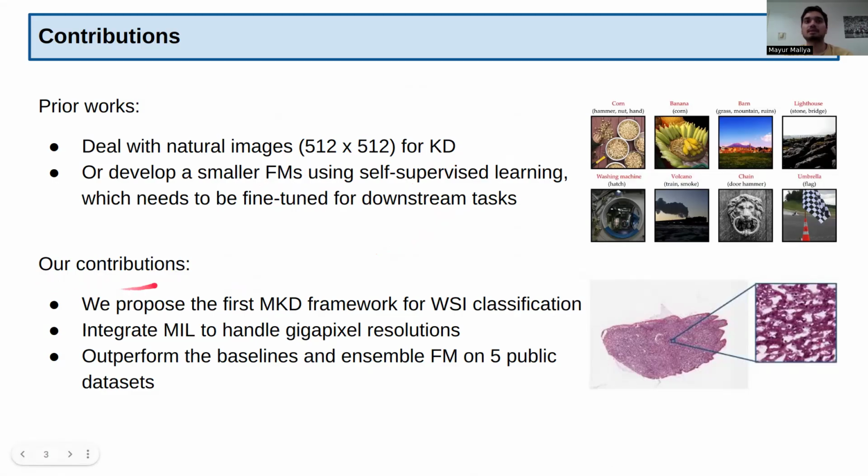So our contributions in this work include the HistoMILKD framework, which is the first multi-teacher knowledge distillation framework for whole slide image classification. We integrate the multiple instance learning paradigm to handle the gigapixel resolution of the whole slide images. And our experiments on 5 public datasets show that the proposed model outperforms the individual foundation models as well as the ensemble model and the competing approaches.